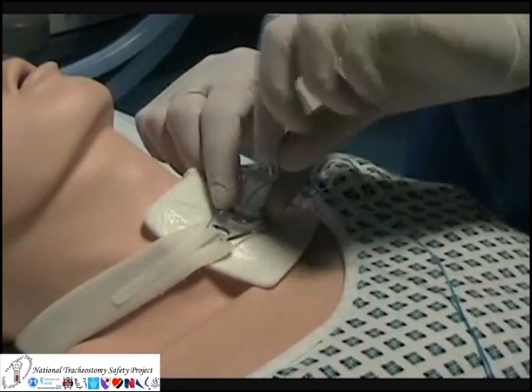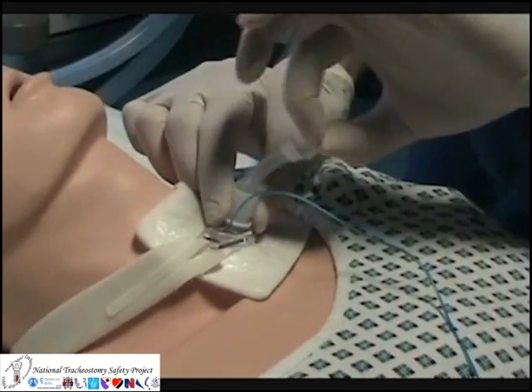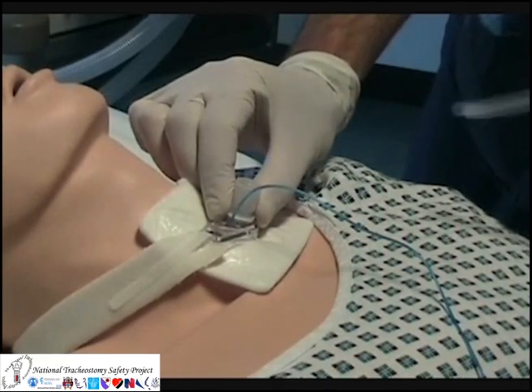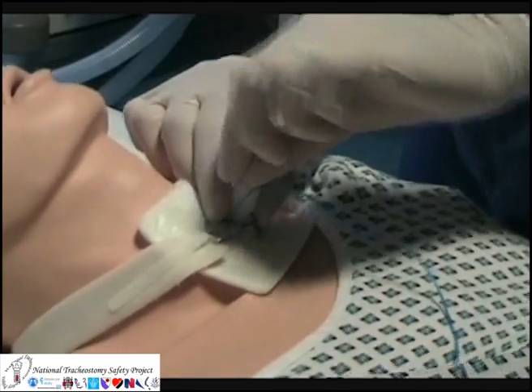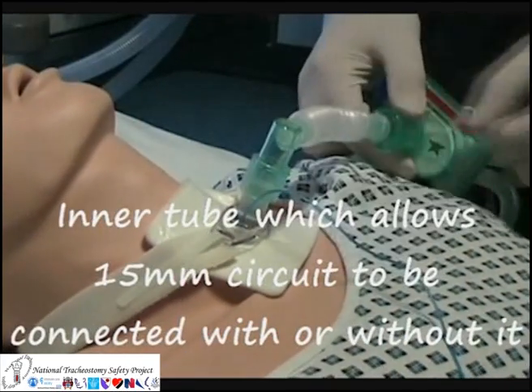Most tracheostomy tubes now come with inner cannulae, as shown here. If the tracheostomy tube becomes blocked, these can be easily removed and will often relieve the obstruction.